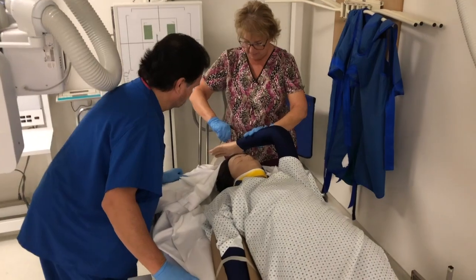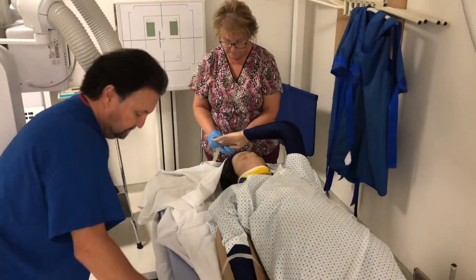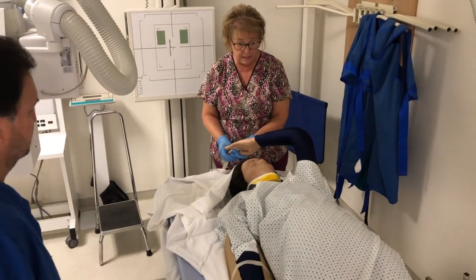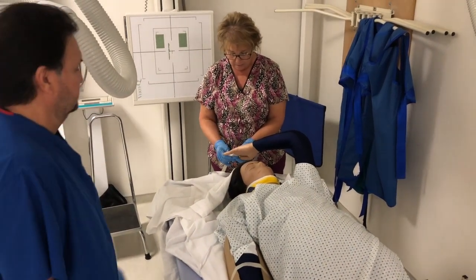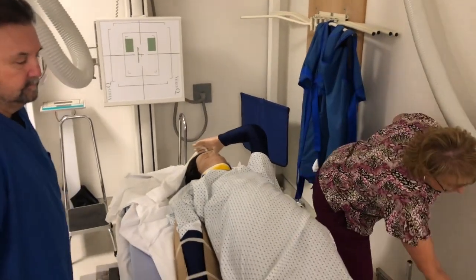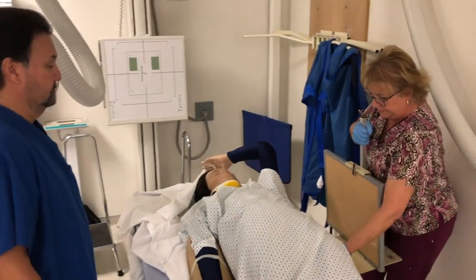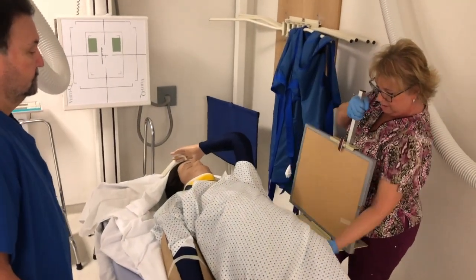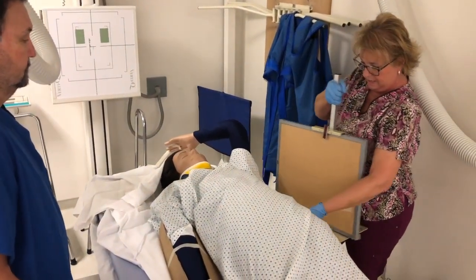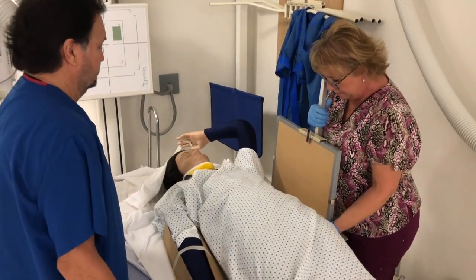That's a completely normal way to do this, and that may be the way they do it at your clinical setting. But we're going to demonstrate with the film holder, and assuming that they are on a backboard, I would slide this under the backboard.